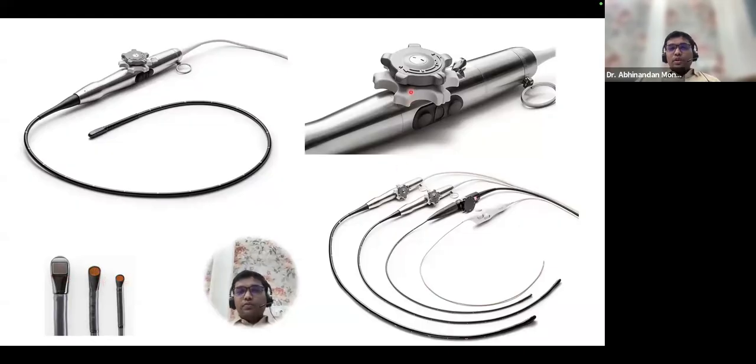And in your control housing, you can see there is a large wheel and a smaller wheel, and there are two switches and there is a lock. We will be describing much more in the coming slides.